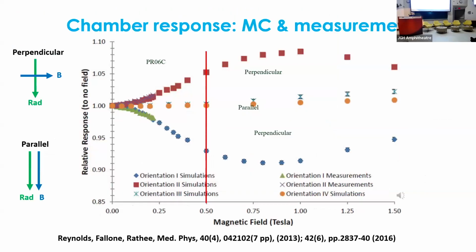Now, does the magnetic field affect the dose? I don't know how many people here are radiotherapy physicists or not. I'm not sure. Assuming none of them are here. You may know why you have medical physicists in hospitals and you don't have medical chemists. There's a reason. In medical chemistry, the prescription is guaranteed by the company. In medical physics, the instrument, the machine, is not guaranteed by the company. The hospital does it. So the first job of a clinical medical physicist is determining the prescription of that machine, something that in drugs the company does.